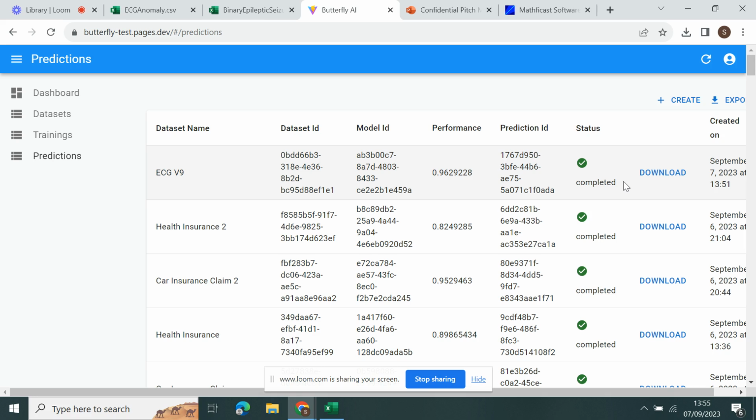That means that Butterfly AI, when it comes to this sort of medical diagnosis, reduces the time and cost to market significantly. Now, another very important feature of Butterfly AI is that it is a problem agnostic solution. That means that it's not customized for any specific medical prediction or medical classification or diagnosis problem. So let me explain this with a live forecast and prediction.